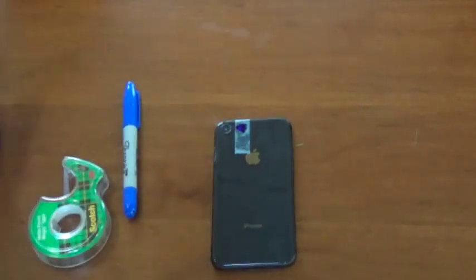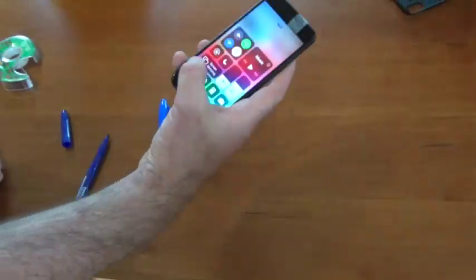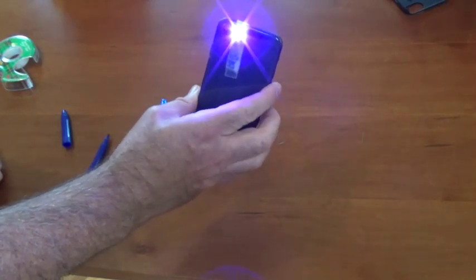Do this two more times so you have a total of three layers of tape that you've colored in. Now turn on your flashlight app. Ooh, looks kind of ultraviolet-y, doesn't it?